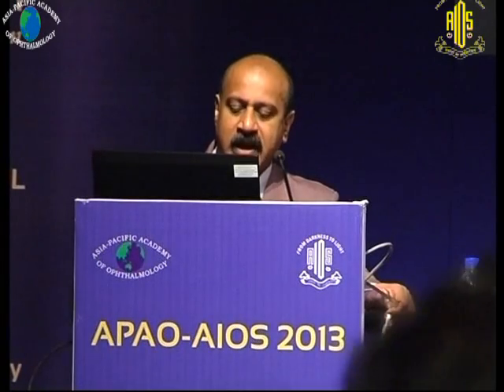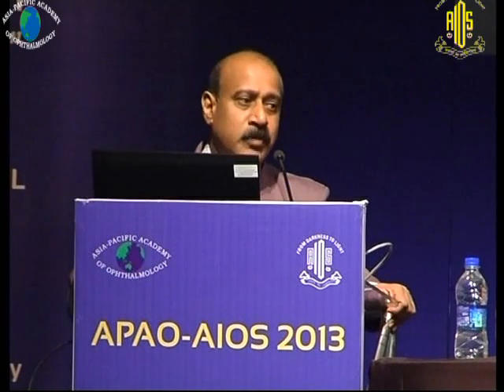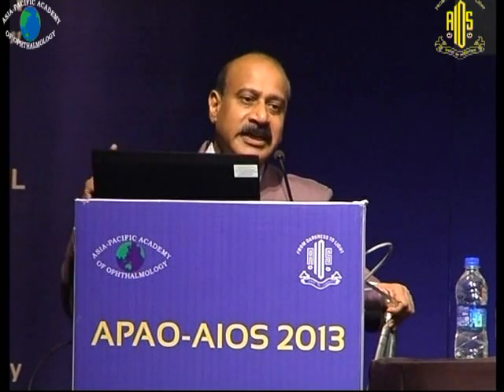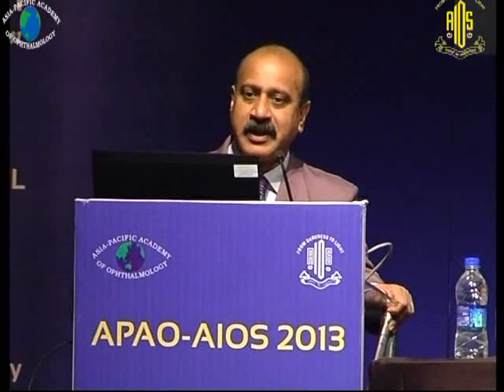Giant retinal tears will be dealt with later, but definitely an indication for vitrectomy rather than scleral buckle. If you are going for a scleral buckle in giant retinal tear, you should not tighten it too much, because the indentation itself will worsen the slippage. Though the perfluorocarbons always take care of the slippage, they should be used along with the vitrectomy.